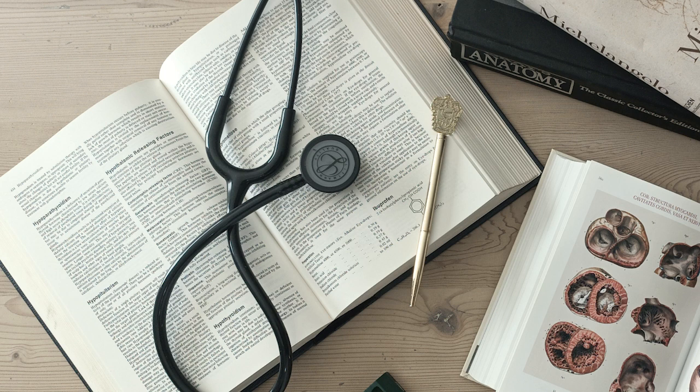Got it. Now, let's shift to disorders of impulse conduction, specifically heart block or atrioventricular nodal block. This is where the AV node itself is the bottleneck or the problem. That's right. These problems fundamentally arise from pathology within the AV node, impairing its ability to conduct electrical impulses effectively from the atria down to the ventricles. Our analysis here relies almost entirely on systematically assessing the PR interval. That little segment of the ECG becomes your guiding star for AV block.